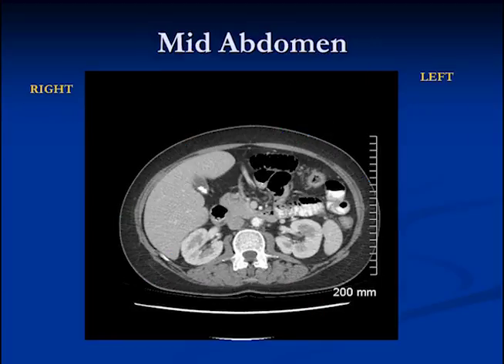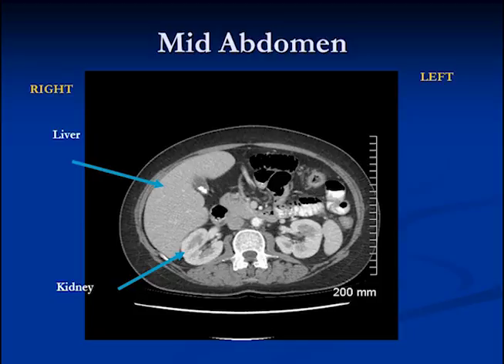Going down a little further in the abdomen, we get some other structures. We can see the liver again, and now we notice the kidneys because we're lower down. The kidneys are bilateral, and you can see the cortices and medulla are well defined when we give IV contrast. This is the spleen. We have the gallbladder here, and there are some calcifications within the gallbladder — these are actually stones.